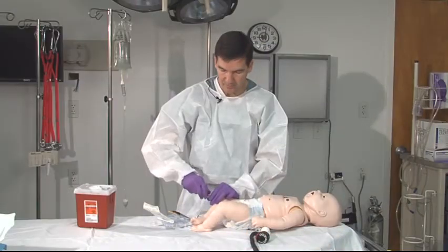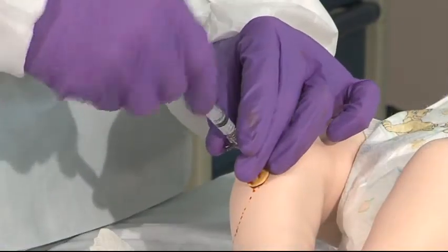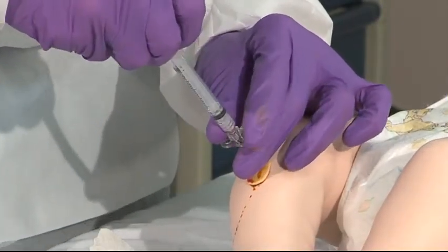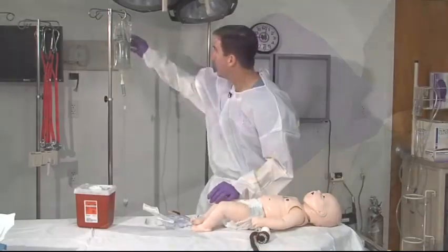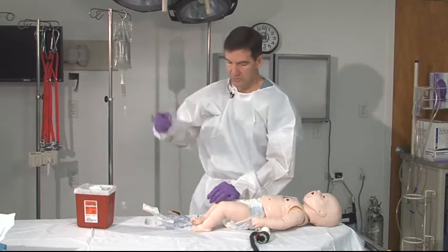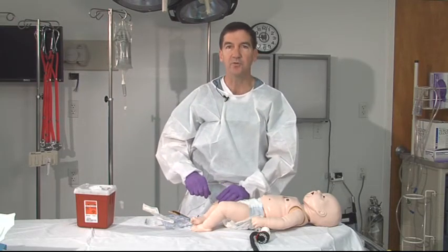Remove the trocar. Aspirate to make sure that you get marrow back. Once you see that, you know you're inside. Apply your fluids and continue with your resuscitation.